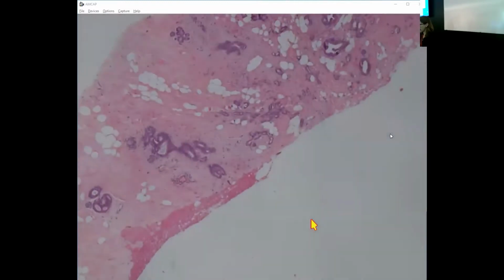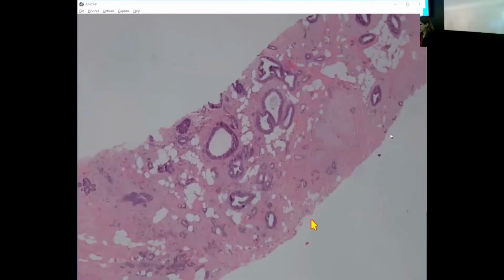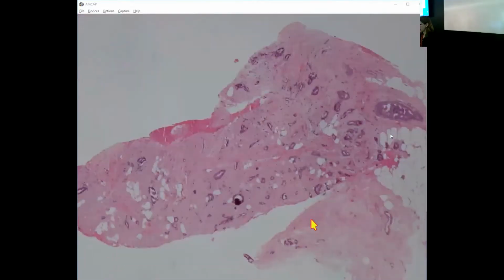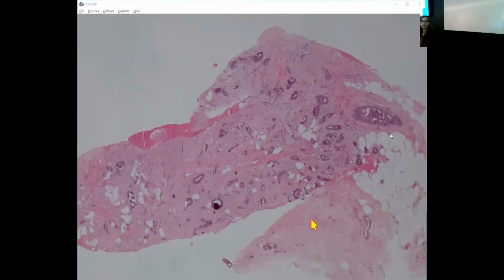So this session is on small glandular proliferations, and it'll build on some of the things that we've been talking about already. I think I briefly showed you this earlier, I had my slides in the wrong order. But this is the archetypal small glandular proliferation, right?